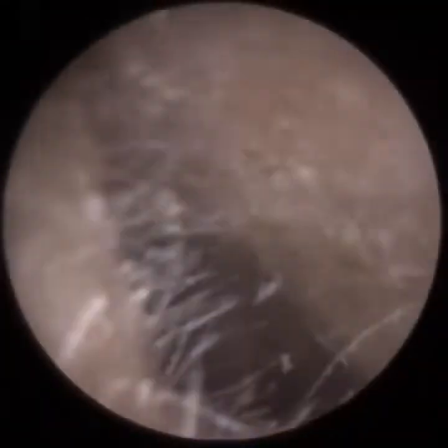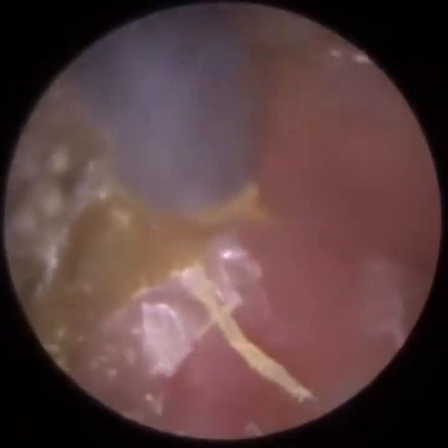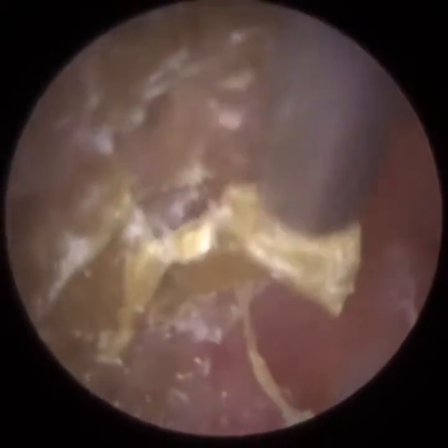The skin is less crusted and a bit more sticky. I believe this is the last remaining piece of dead skin in the patient's right ear.